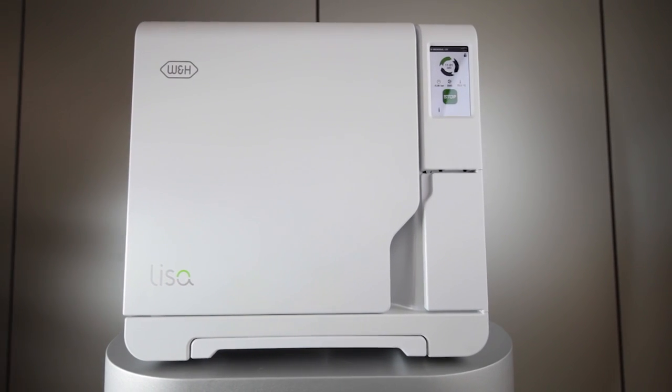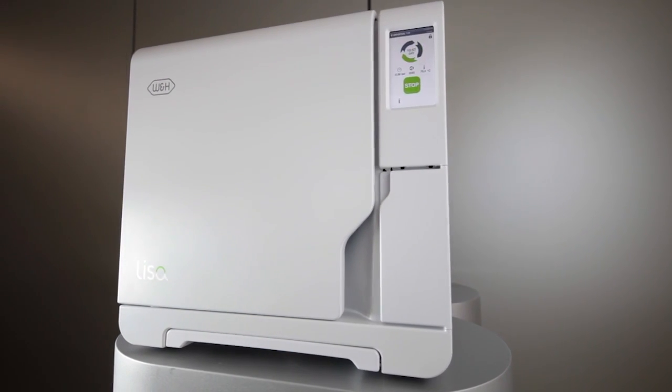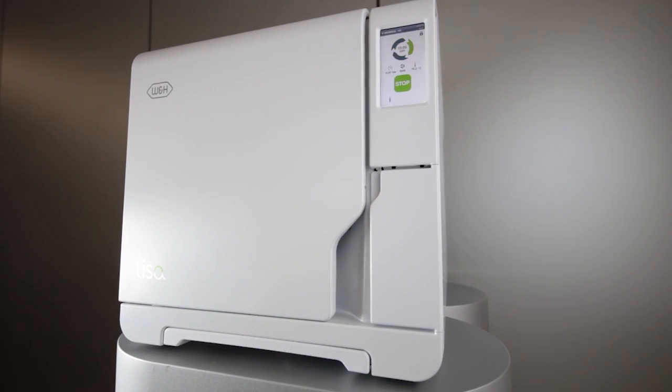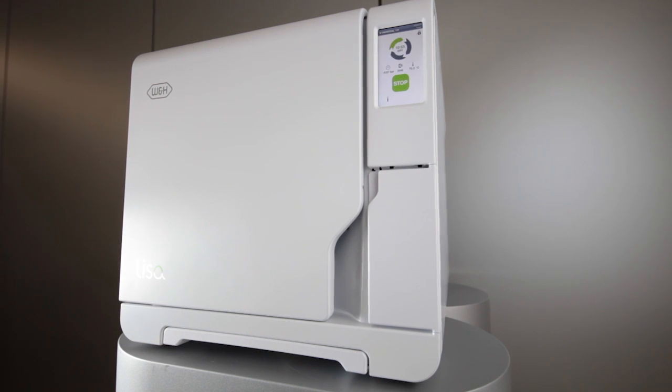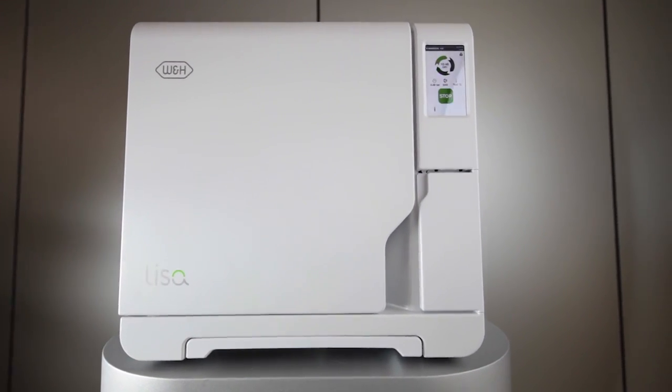Modern sterilizers are subjected to regular tests during their lifetimes. Because the W&H Lisa is a Class B vacuum sterilizer, a steam penetration test must be carried out as described in your National Hygiene and Decontamination Guidelines.